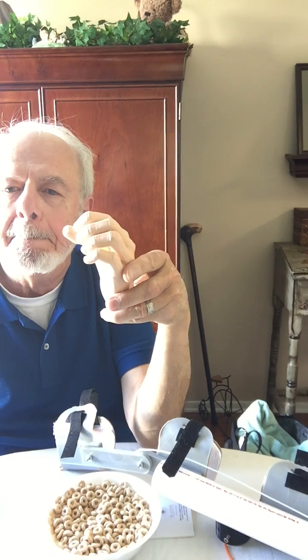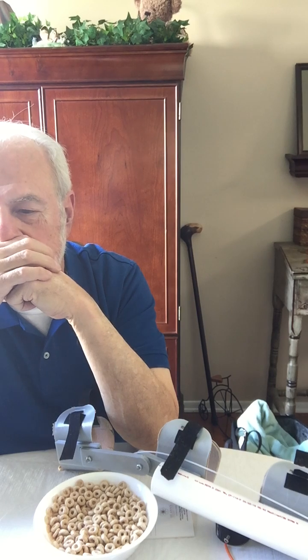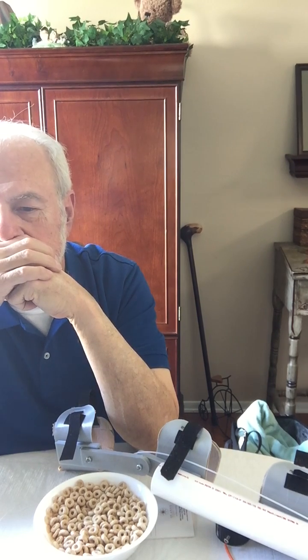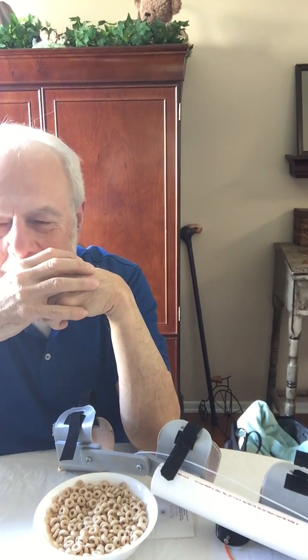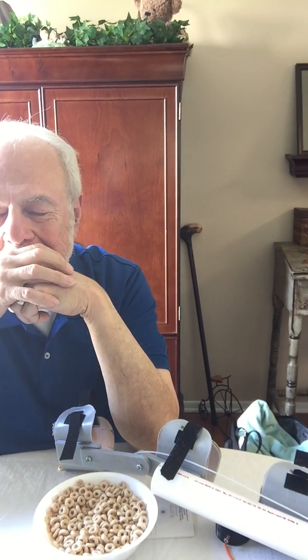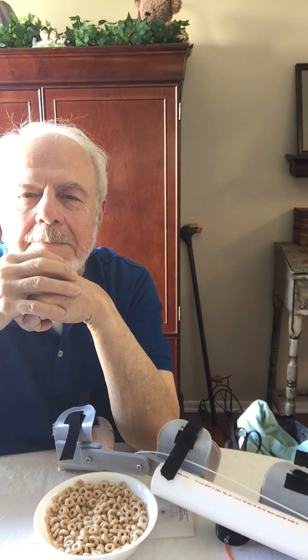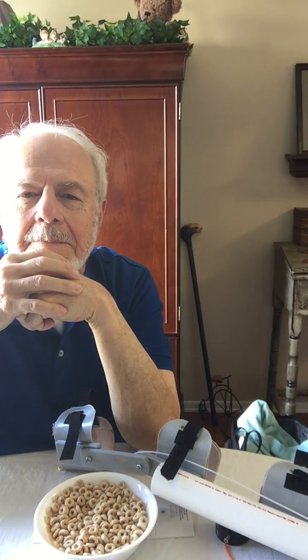Thank you. Right. And for the challenge, for something specific to a sport, it's certainly likely that for certain sports it would just be the shape of the item. It doesn't even have to necessarily look like a hand. Definitely people should think outside the box. This does not have to look like a hand. But the whole idea of the modularity is a very important concept. Even though we're focusing here on sports, this has a big impact in a lot of ways on vocational aspects as well.